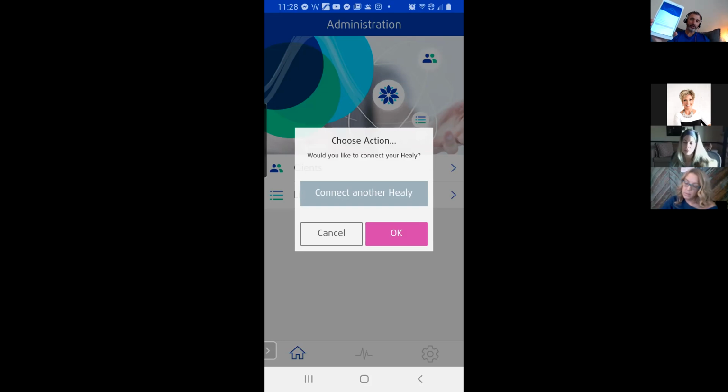Now, if I had to redo it, honestly, what I might do instead of getting the pad is get a second used cell phone off Craigslist or Facebook Marketplace that's decently new, because the pad is a little big, right? So if I wanted to do Healy vibrations while I'm walking around the house or walking somewhere, I've got to carry this with me to make sure it's still running.